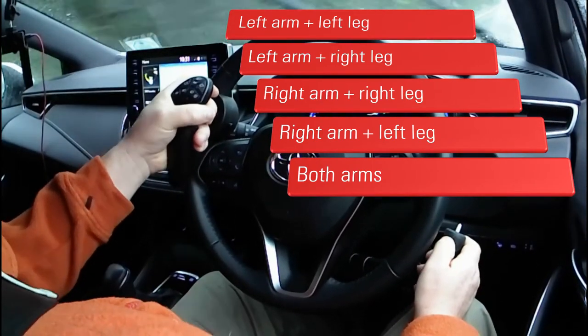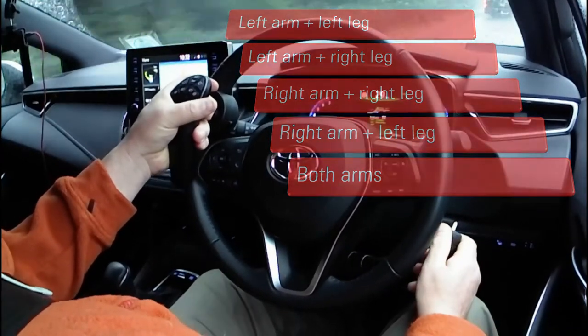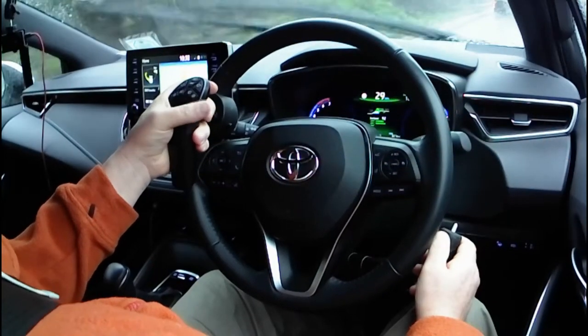So left arm holding the steering control as I am now, and right arm controlling the accelerator and the brake with this lever by my right leg.